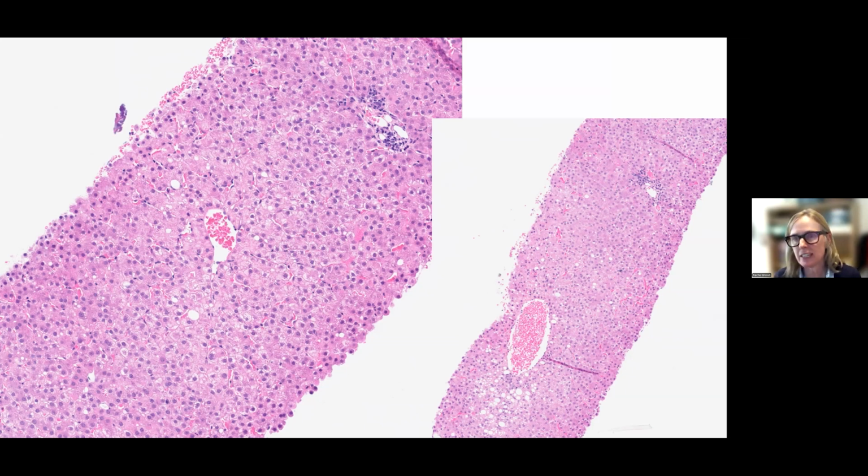You also got some of these structures that look a little bit like those pseudo portal tracts we were just speaking about, and things that look like central veins. So we're even at a point in this biopsy of wondering, am I looking at lesion or not? We've been told that the patient's got cirrhosis. It doesn't obviously look cirrhotic in what we've got here.